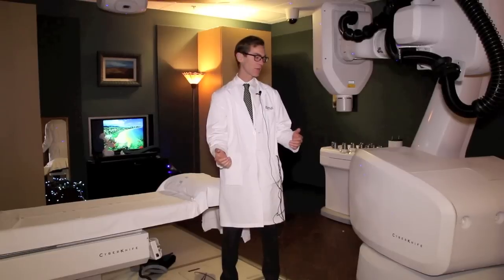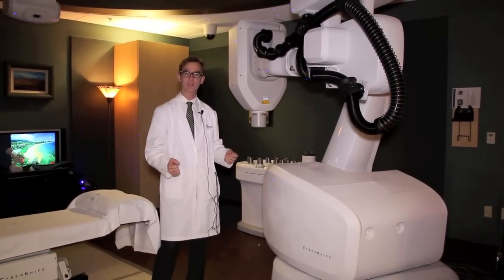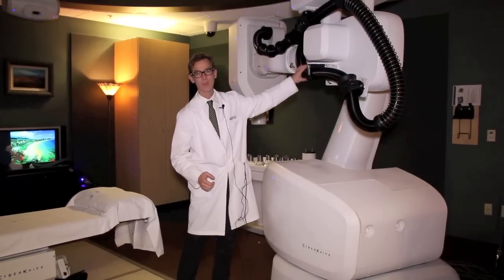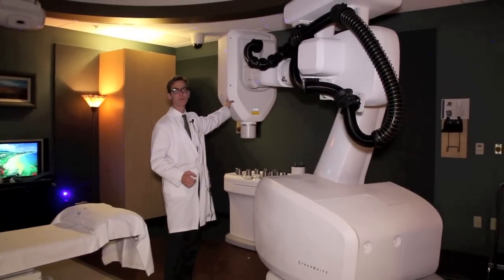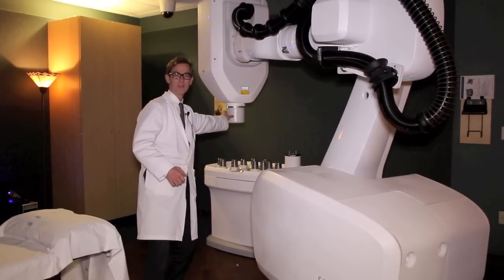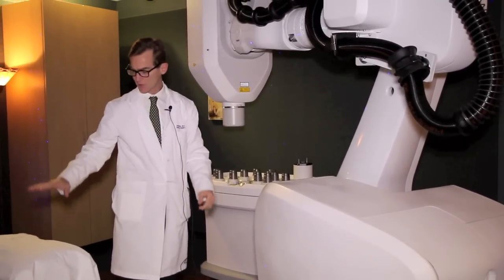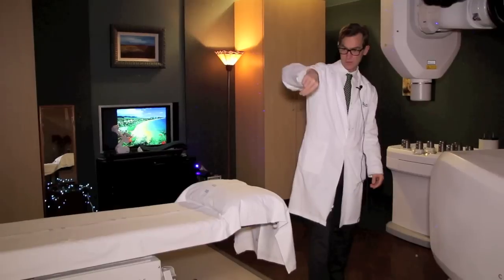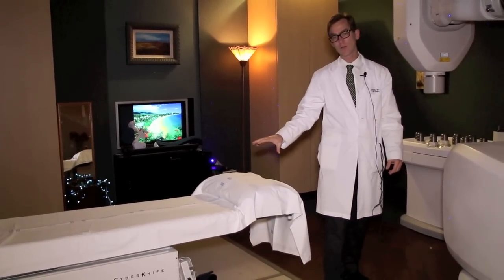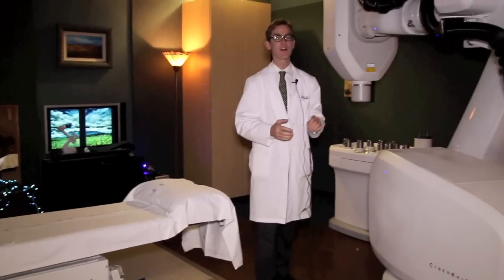So we talked about a linear accelerator on a robot that moves around and shoots beams at different angles — the prototype of that is called the CyberKnife. This is a CyberKnife. It's a gigantic heavy robot, the same kind used to spot-weld cars in an assembly line. You can see this massive cable sending a huge amount of electricity up to the linear accelerator, where electrons hit the tungsten and get shot out the end of this collimator. Different collimator sizes change the beam size. This device moves around, the patient lies right here, and it shoots beams of radiation at different angles into the tumor with rapid fall-off in the surrounding area.